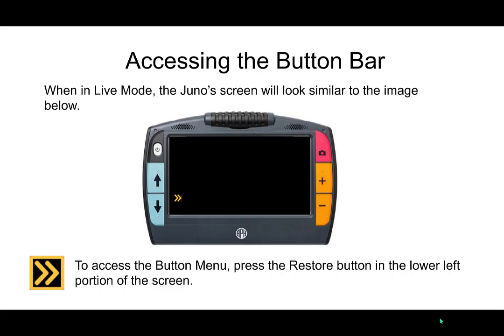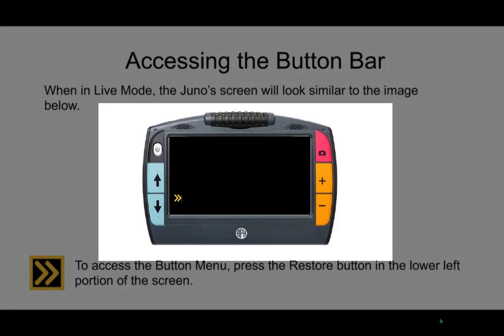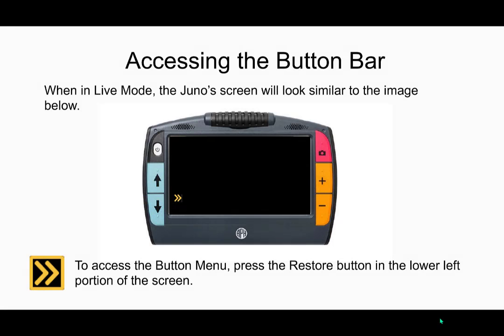When you're in live mode, the Juno screen will look similar to the image below, which is just a picture of the Juno, except it has a very small square in the lower left-hand corner, and it's got 2 arrows pointing to the right. This is the restore button, is what they're calling it. And of course, you need to double tap it to show those menus that are on screen, and it hides them when this button is out of view.